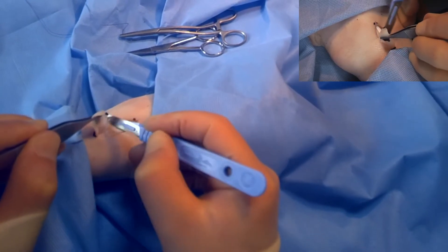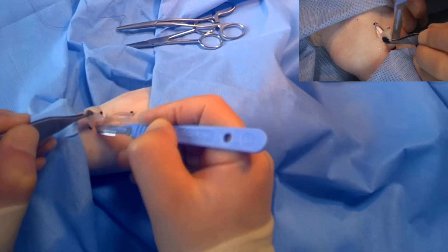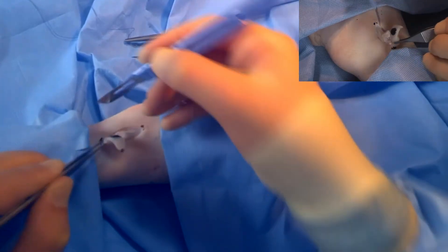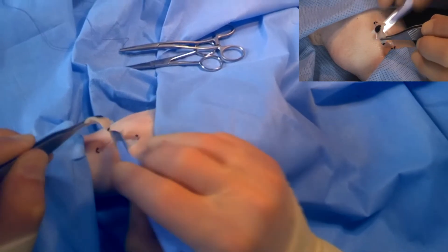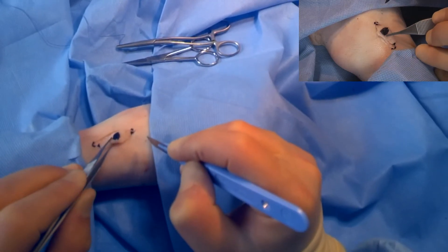It's important to take the lesion all in one piece, and it's also important to make sure you keep the orientation. We can then mark one end with a suture to identify which side it is.